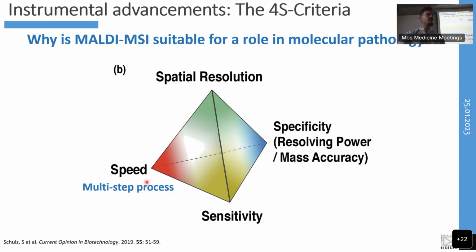So quite commonly in certain pathological instances, it can require a multi-step process to be able to obtain a diagnosis. Histopathology, light microscopy, electron microscopy, immunofluorescence, immunohistochemistry. So in order for this technology to have a benefit for a pathologist, we need to do something that improves upon that. So we need to have something that's quick. And the new technology can provide this particular aspect.